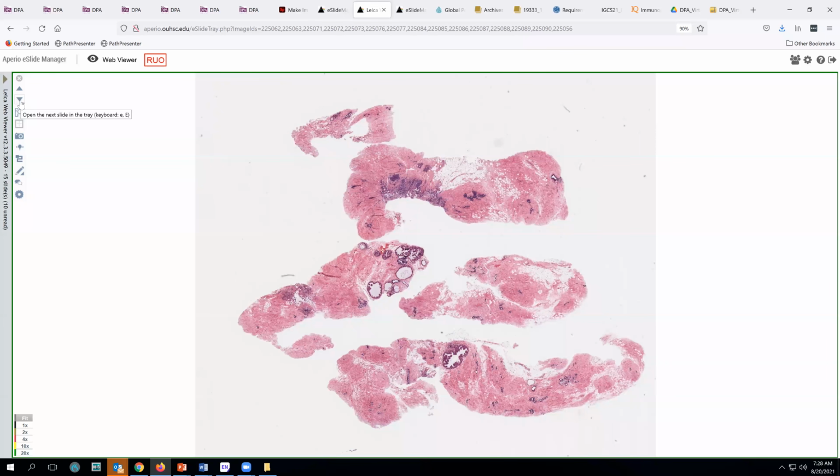All right, well, in the next few minutes, I thought we would launch into a somewhat different area of pathology and talk about breast biopsies. I see many of my colleagues here and good friends from Vietnam have joined the talk. And I know you see a fair number of breast biopsies in your practice.